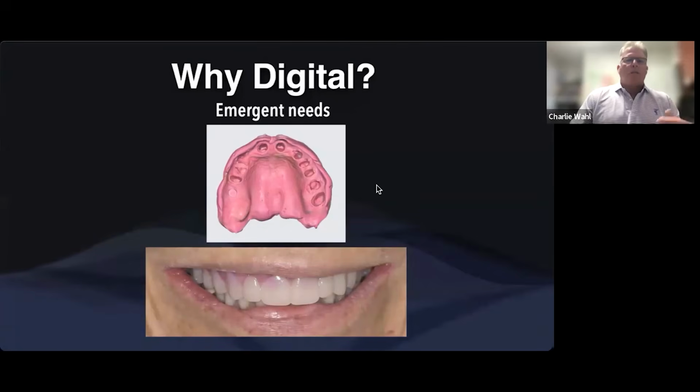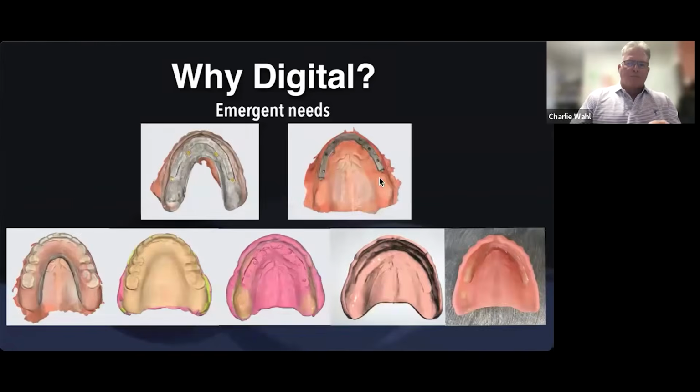Now the patient can get her teeth out. She would always have teeth to wear, kind of our immediate denture version over preps. Let her heal. We would verify tooth position, and now we can know exactly where we want to put implants. Very difficult to do in the analog world. So in 2 visits, she was able to have a denture that she could get through the extractions on her own time. And then we would use that to plan for implant placement.